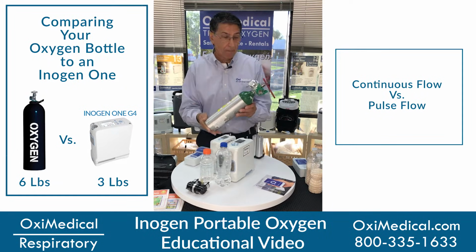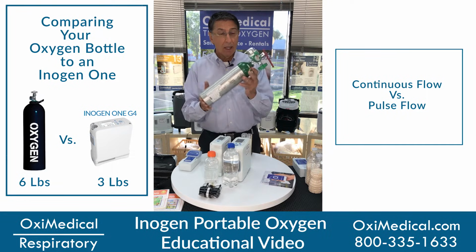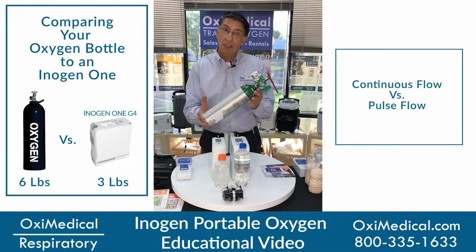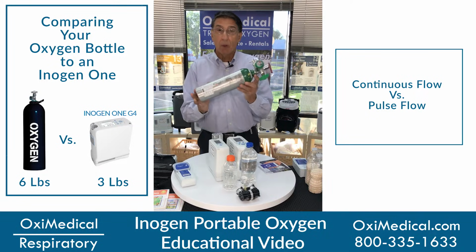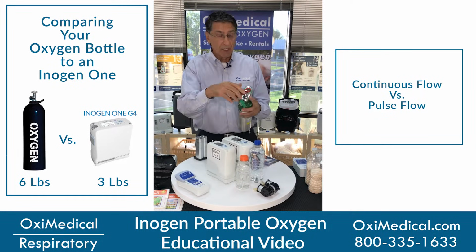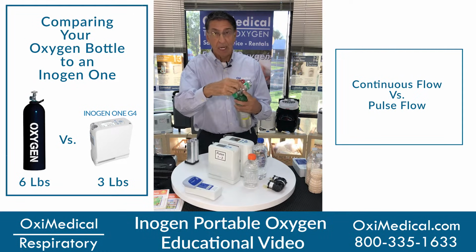Let's go over the difference between a portable oxygen concentrator that you have here in comparison to an oxygen cylinder that your supplier delivered to you. To start with, you can't take an oxygen cylinder on an airplane. You can't plug it into your car outlet, so you don't have endless oxygen. You have to get these ordered and delivered. Secondly, you have to change the regulator on top, which may leak, may not leak every time you open it up.